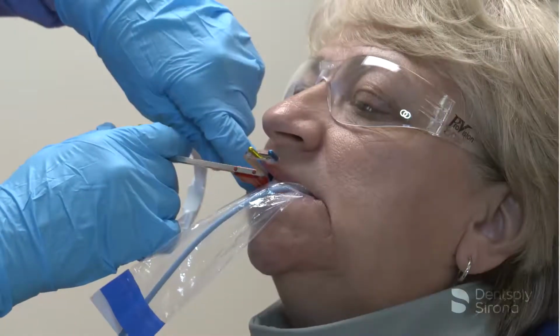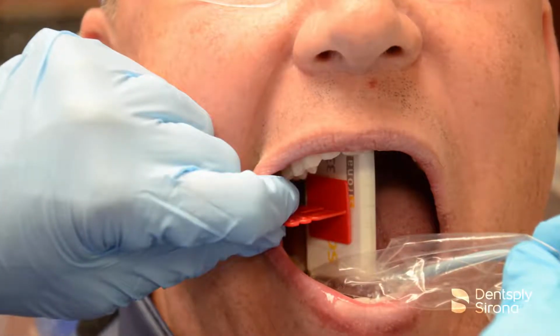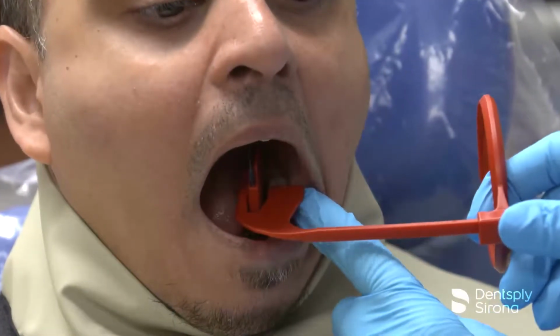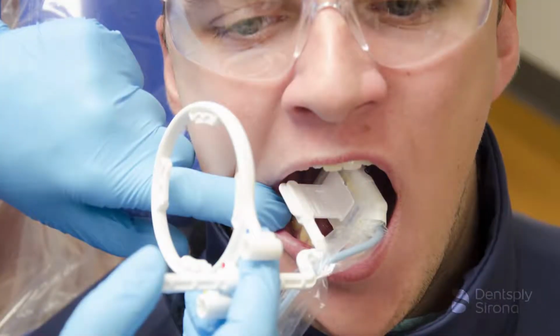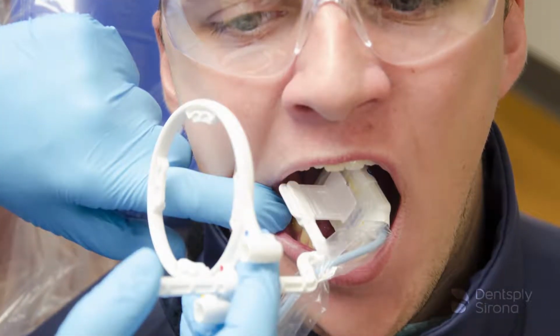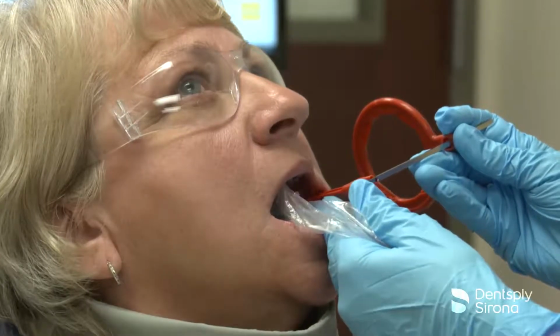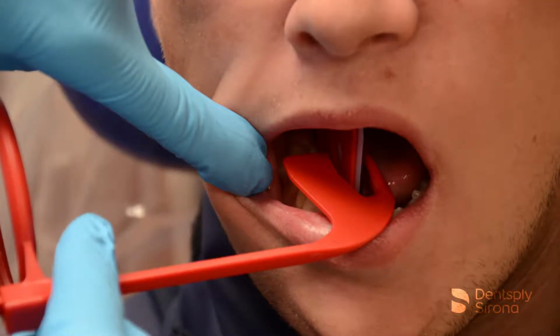Bite-wing radiographs are considered part of the routine dental assessment. It may be 5 to 7 years between full mouth sets, and bite-wing X-rays are an important diagnostic tool to monitor disease and health during this time interval. To properly detect caries and periodontal disease, it is essential to capture open contacts between teeth and maxillary mandibular bone levels. It is important to ensure that the central ray is perpendicular to the image receptor.